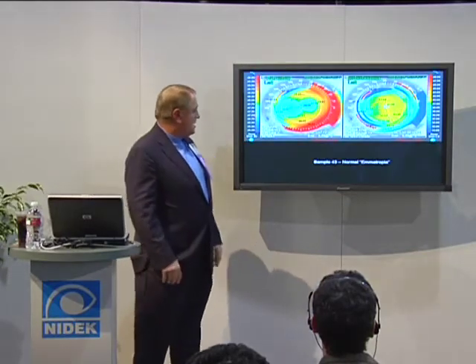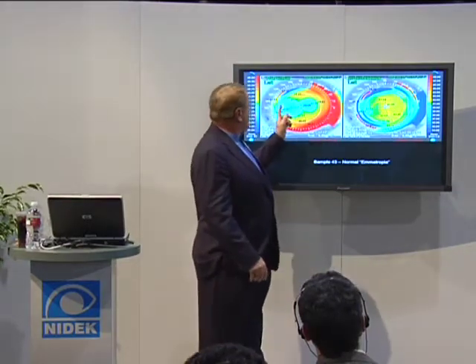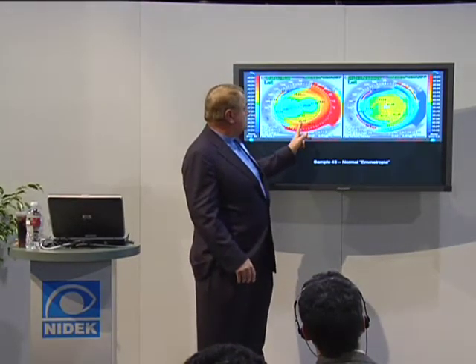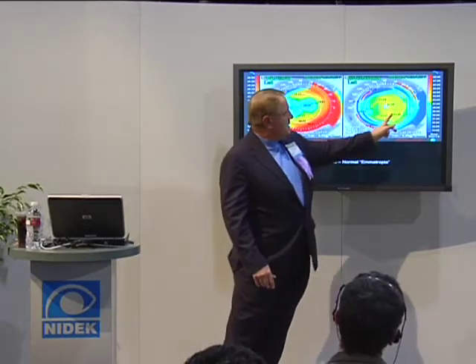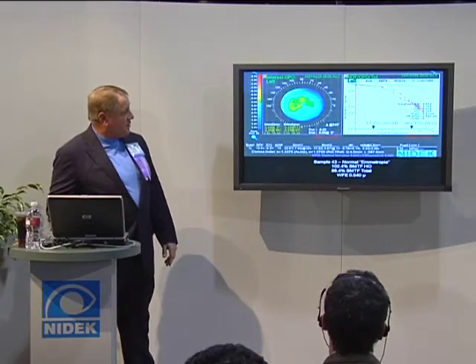Topography. Nice little bow tie right here. This is the refractive map with with-the-rule astigmatism. The tangential map shows you the detail of that.